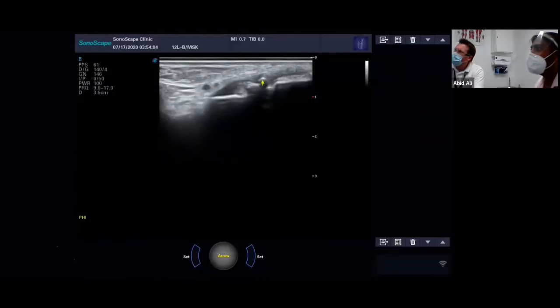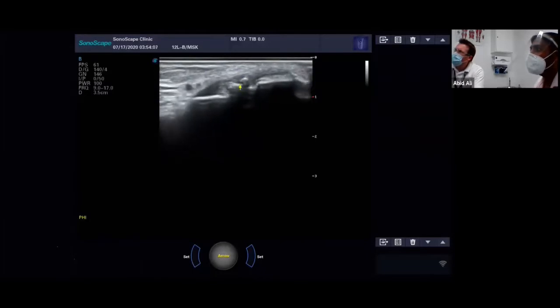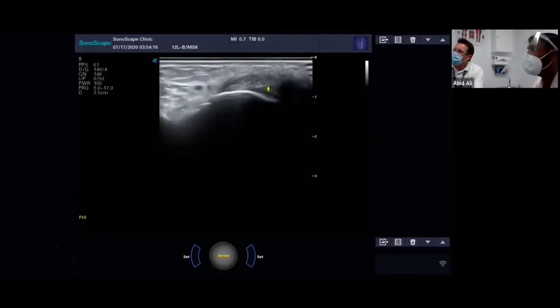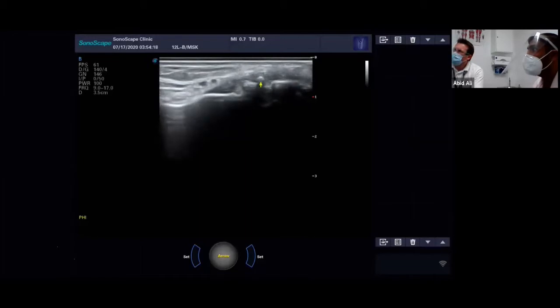The bone is suddenly not congruent. It's got this little extra bit sitting on the top, and that's where Adrian's ATFL should be attaching, but we were struggling to make it out properly earlier.